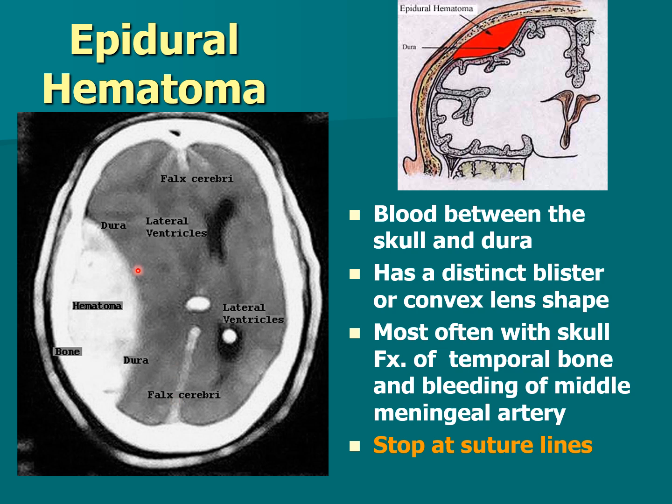So you can see that you get a shift. That's called the mass effect. It's really shoving the brain over to the side. It's shoved it way over here. And it's so much compression that it's completely closed this ventricle off here. So we get a mass effect.